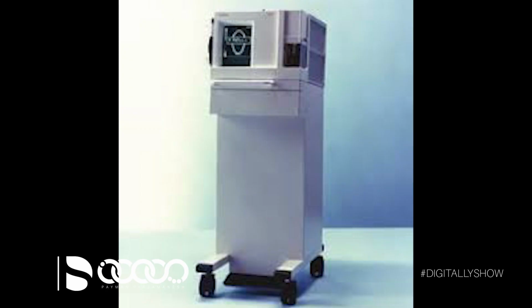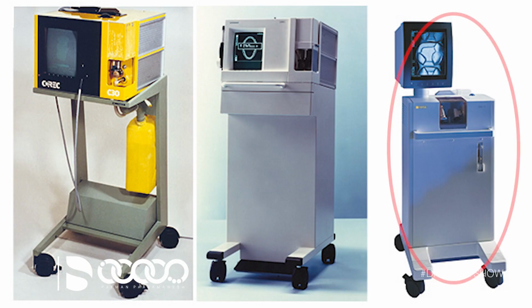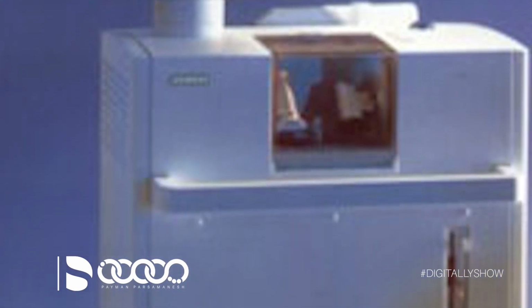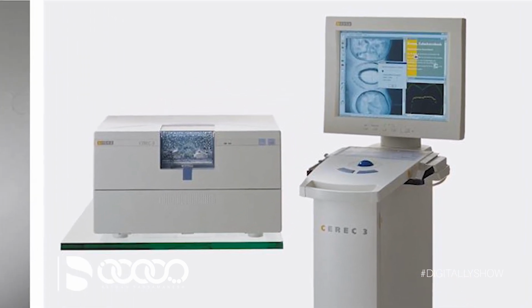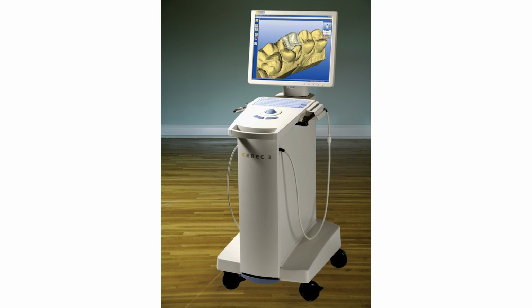Two years later, CEREC 1 was introduced to the dentistry world and became the first functional chairside equipment ever. Later, in 1994, Sirona introduced CEREC 2, which, using two-dimensional concepts, could produce inlays, onlays, veneers, partial and complete crowns and copings. In 2000, Sirona launched CEREC 3, but 5 years later, Sirona released a different version which did everything CEREC 2 and CEREC 3 could, plus virtual automatic occlusal adjustment.